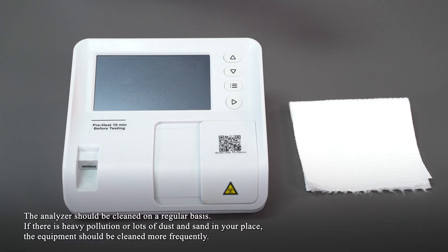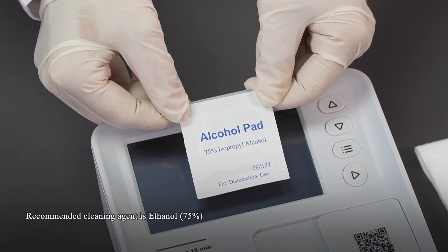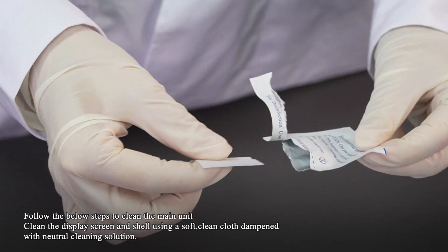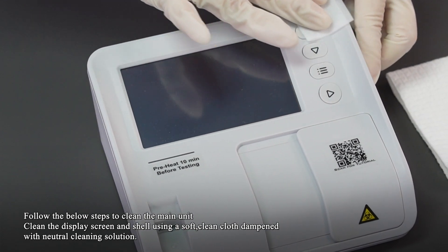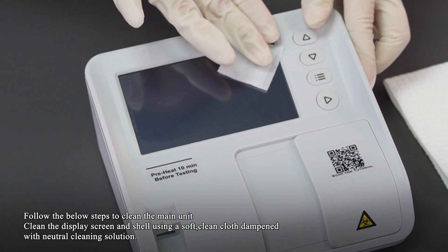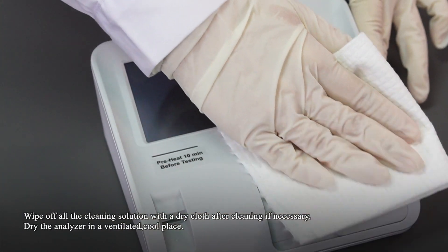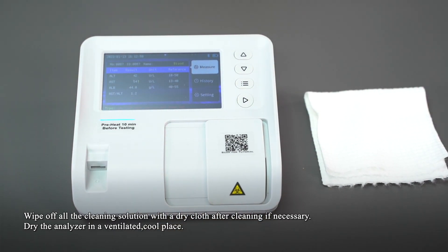The analyzer should be cleaned on a regular basis. If there is heavy pollution or lots of dust and sand in your environment, the equipment should be cleaned more frequently. Turn the analyzer off. The recommended cleaning agent is 75% ethanol. Follow the steps below to clean the main unit: clean the display and shell using a soft clean cloth dampened with neutral cleaning solution. Wipe off all cleaning solution with a dry cloth after cleaning. If necessary, dry the analyzer in a ventilated, cool place.